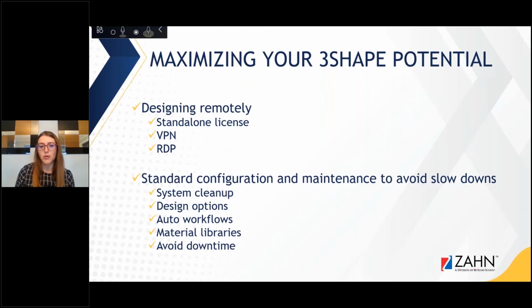And I want to go over all of the types of setups that you can use for designing remotely, depending on what you might need it for. So we'll go over all of those. We'll go over having a standalone license, a VPN, right? That's something that comes up a lot, but what really is VPN and how it's used, and RDP, which is remote desktop access, basically.